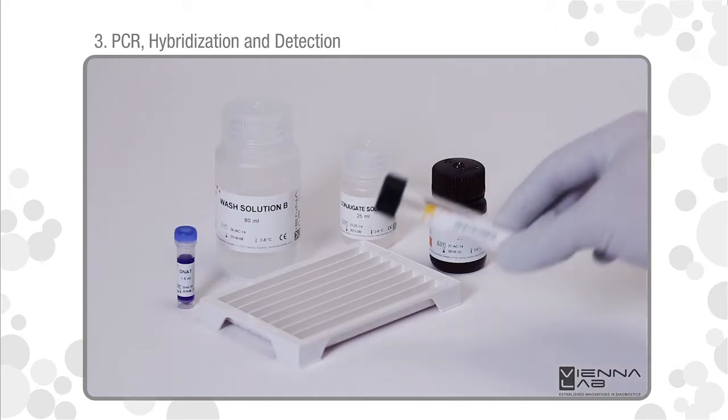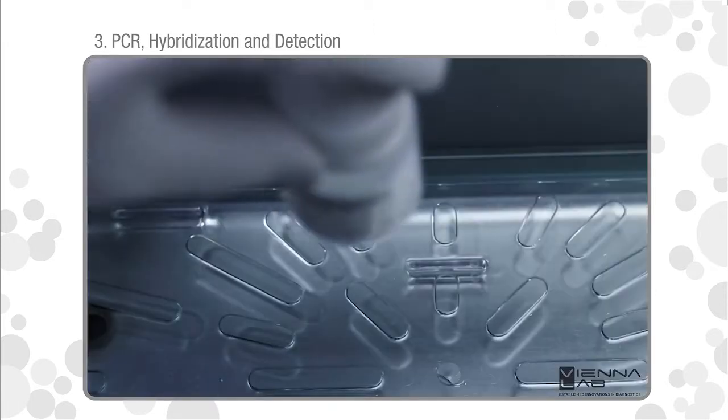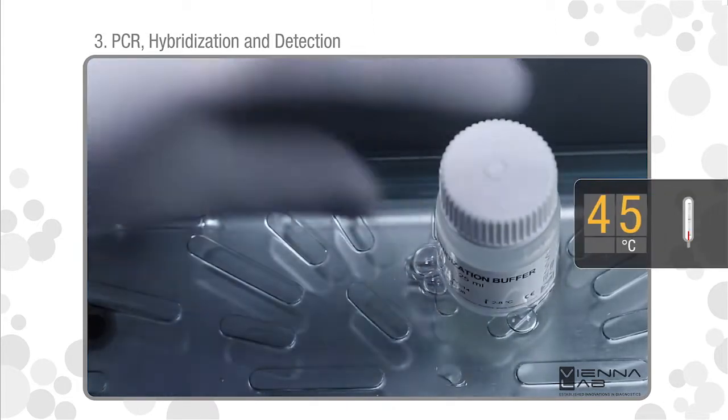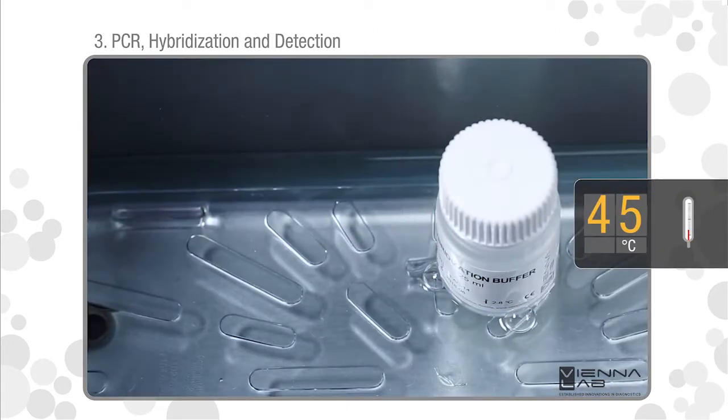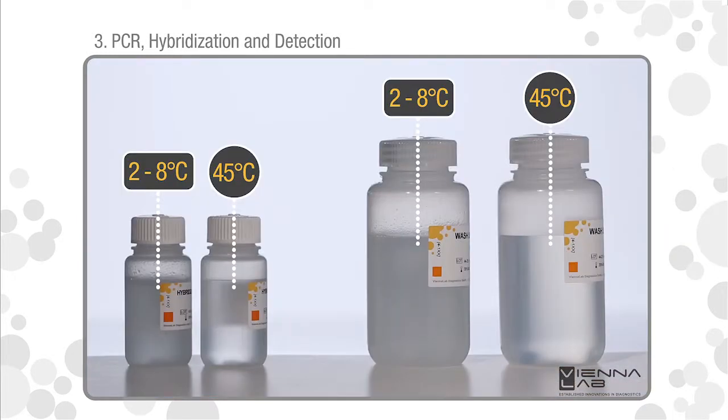Allow test strips, DNAT, conjugate solution, wash solution B, and color developer to reach room temperature. Prepare the typing tray. Pre-warm hybridization buffer and wash solution A to 45 degrees Celsius. Take care that all precipitates formed at 2 to 8 degrees Celsius become completely dissolved after pre-warming.